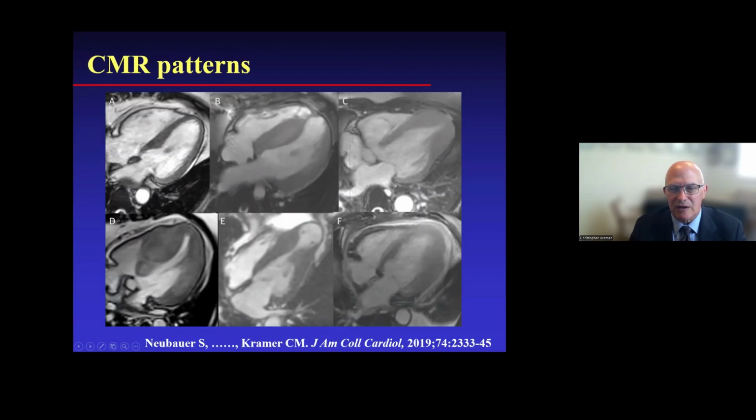About 8%, again, this was out of 2,750 patients with HCM in HCMR, and we'll talk more about HCMR in the second half of the talk. About 8% had apical HCM, 1% had concentric morphology, like patient D, 3% had mid-cavity obstruction with apical aneurysm.